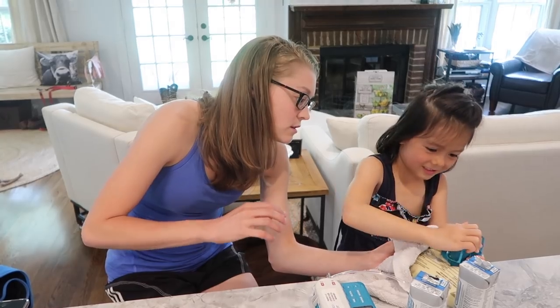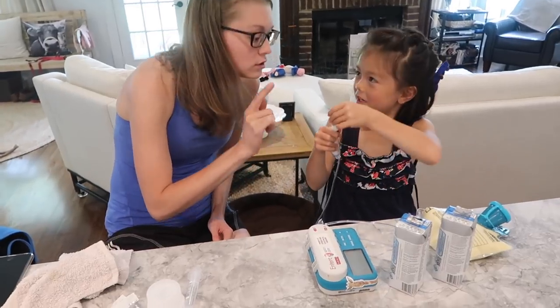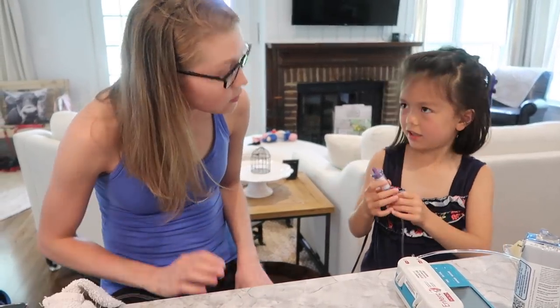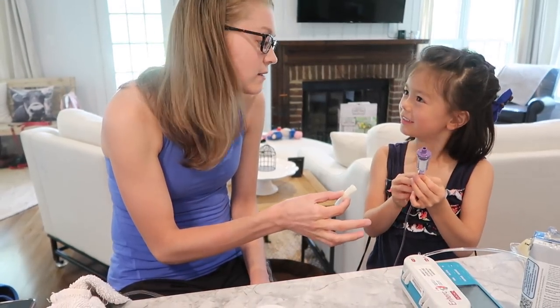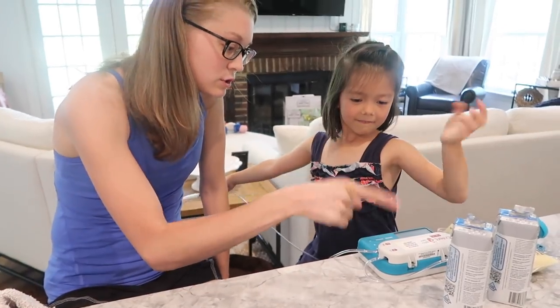Cut it. Yep, and then twist. There you go. Now you take this part off. So you want to explain what you're doing here? I'm putting this thing on. Yep, so you screwed that on, and then you'll put — can I let go of this? Yeah. And then you can put that one on. So you start by pushing the on/off.